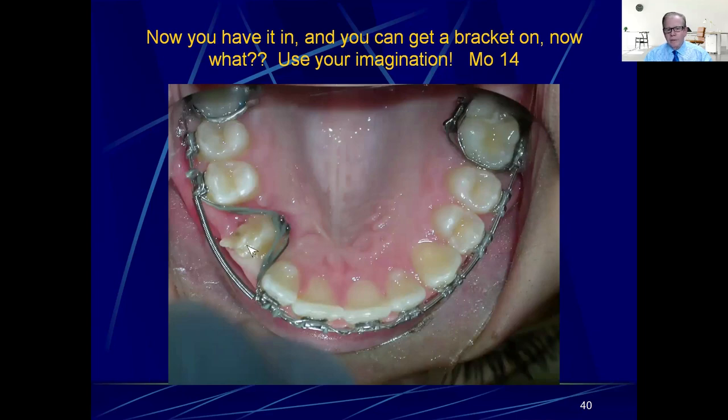Sooner or later the cuspid comes in, and you can see this big giant piece of composite the oral surgeon placed on there. During that surgery you can't really tell where you are on the tooth — buccal, lingual, or whatever — so they just do the best they can. Now it's actually in the arch and you can see it's rotated about 90 degrees. You can get a bracket, button, or something on there. It took about four months to bring that cuspid down, which is pretty good.